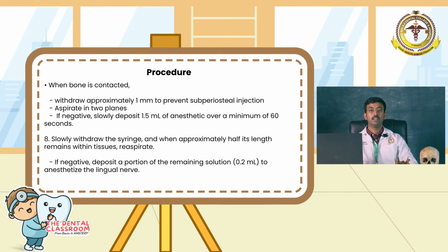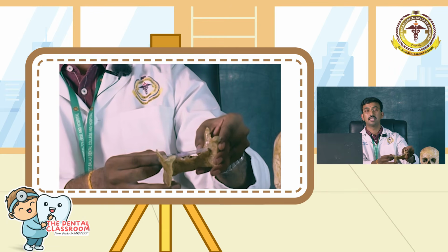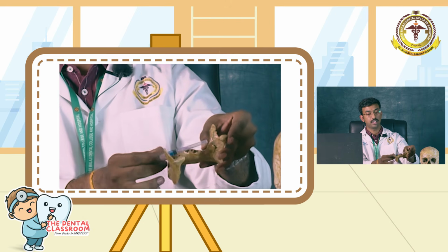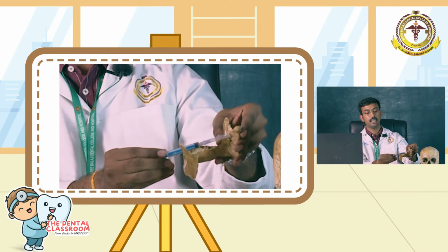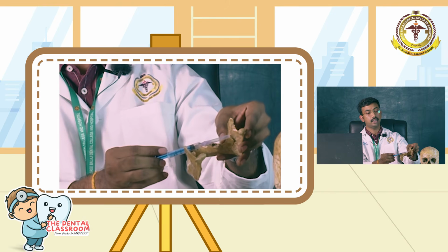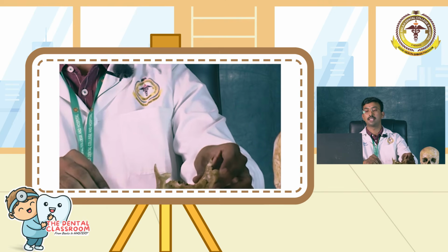So, when we have reached our target area and the bone is contacted, we have to withdraw the needle approximately 0.5 to 1 millimeter to prevent subperiosteal injection. After withdrawing, we have to do aspiration, which is essential for any injection technique. We aspirate in two planes: after placing in the target area, I aspirate in one plane, rotate it 90 degrees and again aspirate in another plane in order to prevent any intravascular injection.